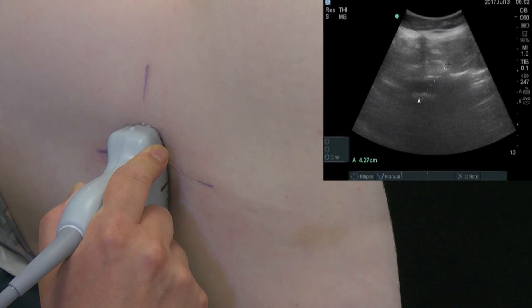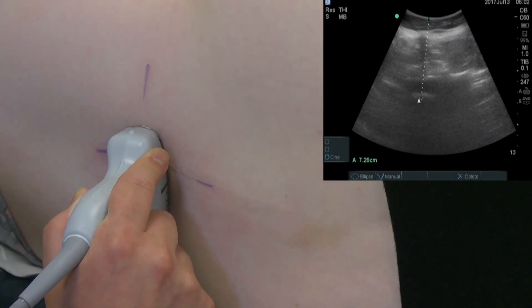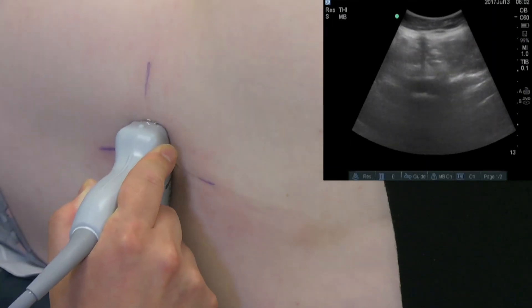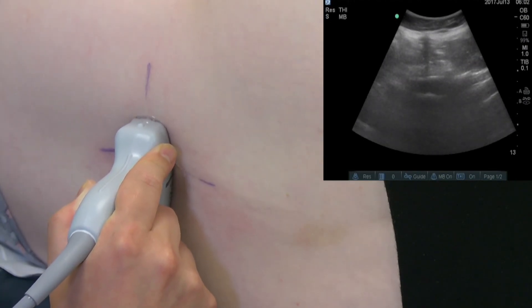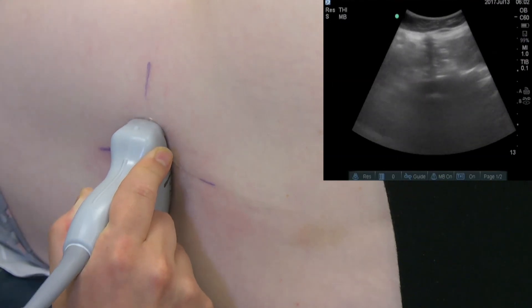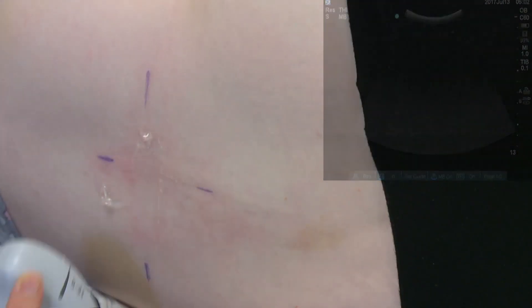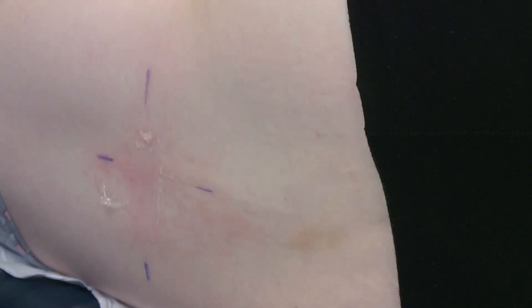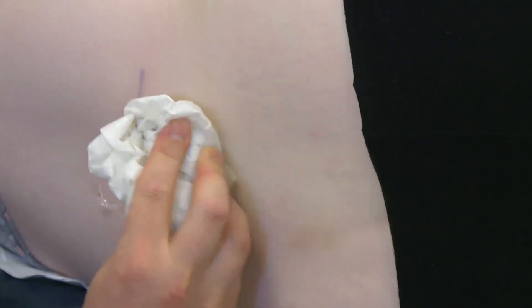Here the depth of the duramater can be measured. Once the landmarks have been marked, the lumbar puncture can proceed as normal.